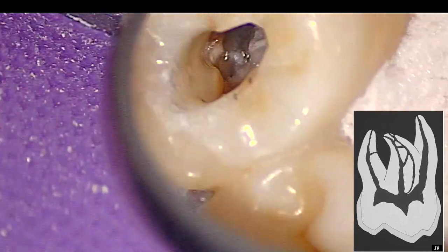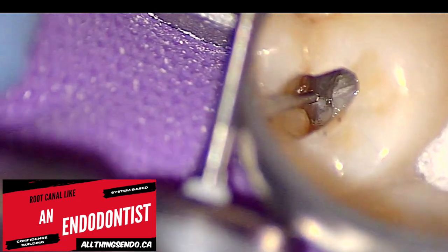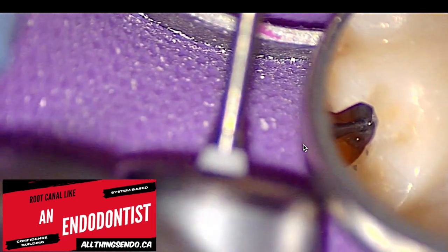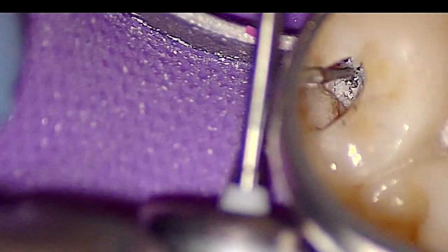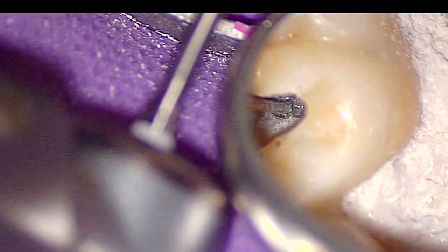So what I'm using is a Munce bur — it's the gray bur, I think it's like a quarter round, very tiny. What we're going to do is slowly trough. First we're going to trough MB1 just to open it up a little bit, and then we're going to trough MB2. Look at that — this is actually the orifice right there. See the angle? It looks like it's angling more mesially. It's white, which tells me that dentin is being placed in it. You can see it moved from there to there already — we're moving mesially. I'm not pushing apically; I'm moving mesially.